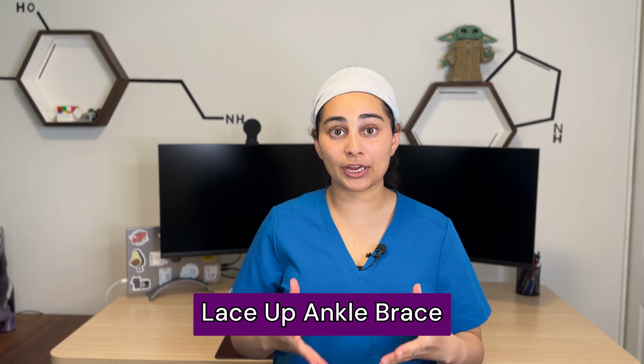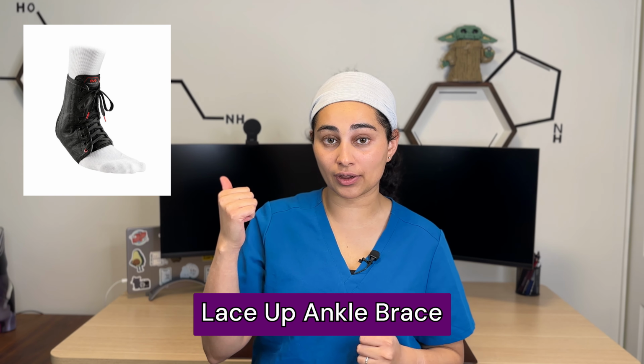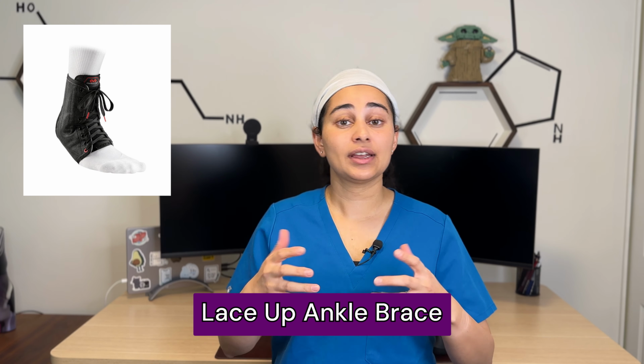So another type of option available for ankles is a lace-up ankle brace. And I'm going to put a picture up to the side. So basically how this one works is you slip your ankle in and then you tighten up the actual laces to help provide a good amount of stability in the ankle. So when you're wearing a lace-up ankle brace, you can't roll in or out your ankle at all. And you also have a hard time kind of toeing off sometimes. We call it dorsiflexion and plantar flexion of the joint.